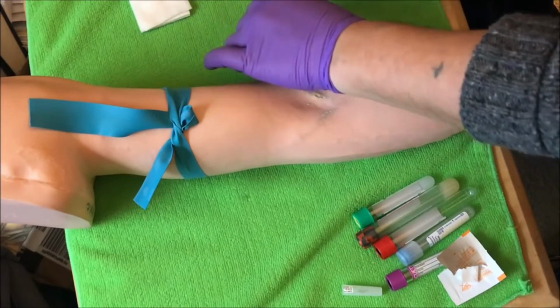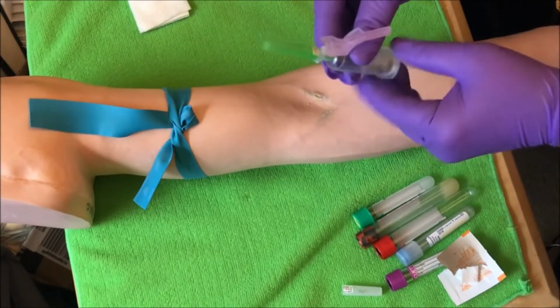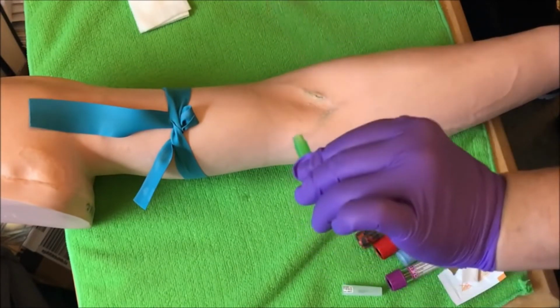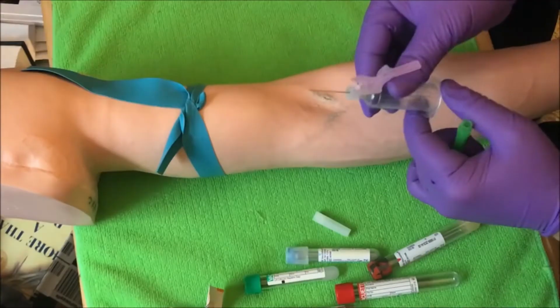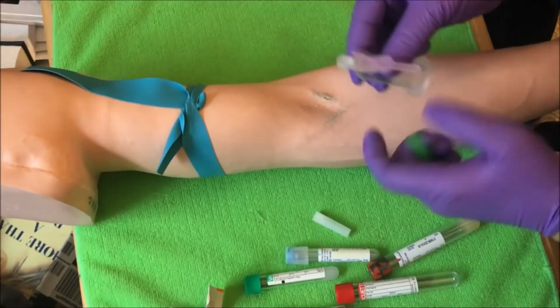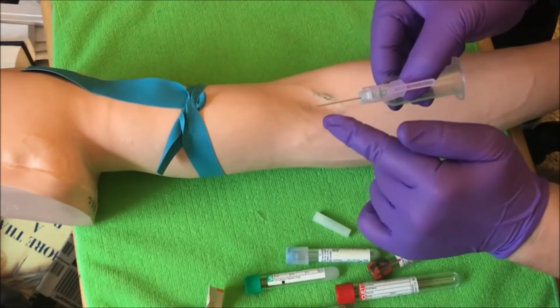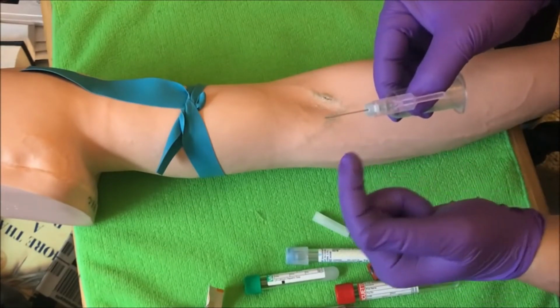So let me show you one more time here. Use the scoop method. Right here, 2 fingers and a thumb, palms down, grip the cap, pull away, set it down, and now you're ready to go and you're ready to draw. This is very important here, because if you look at my needle, the bevel, which is the shaved part of the needle, must be always facing up, and that way the lumen in the needle is facing up.